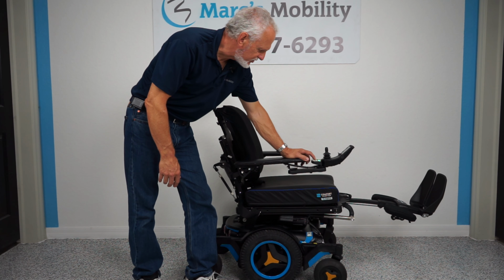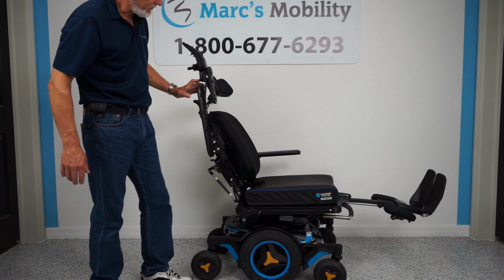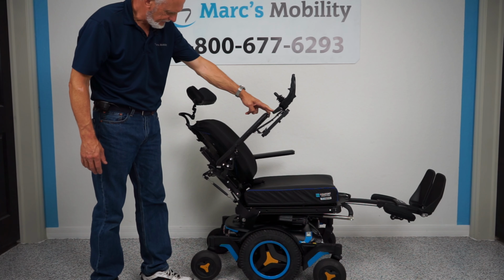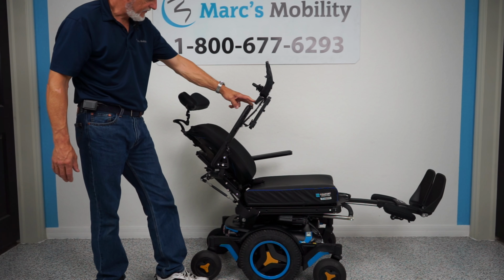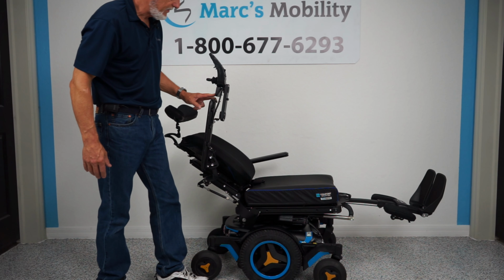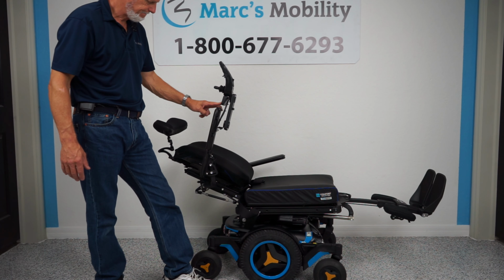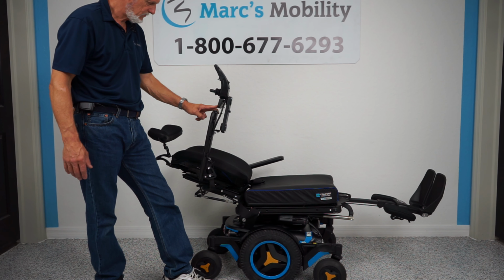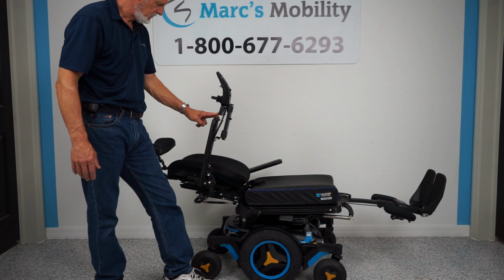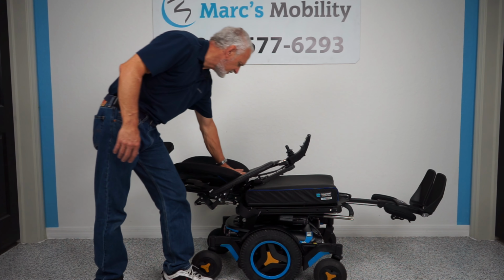The third feature of the chair is called the electric recline. The electric recline is when the back goes back by itself. Okay? This is called the electric recline. And we'll see how far this one goes back. And you can see that the arms do flip up. So if you transfer from the side, there we go. So this is the recline position of the chair.